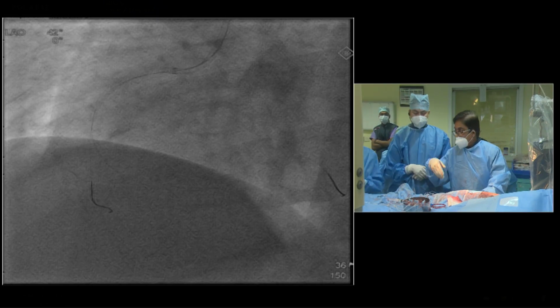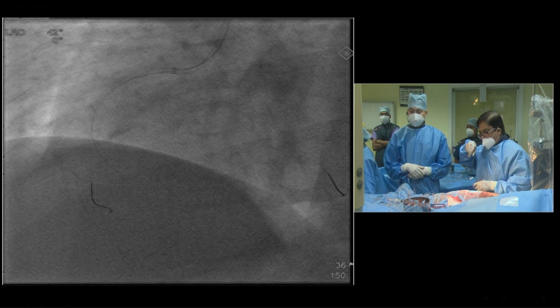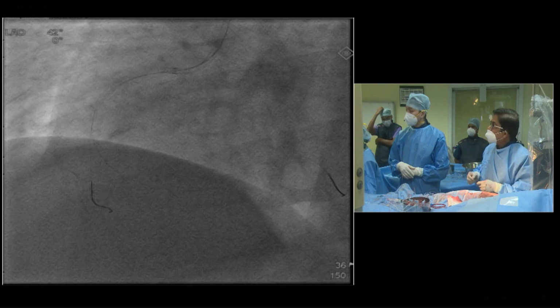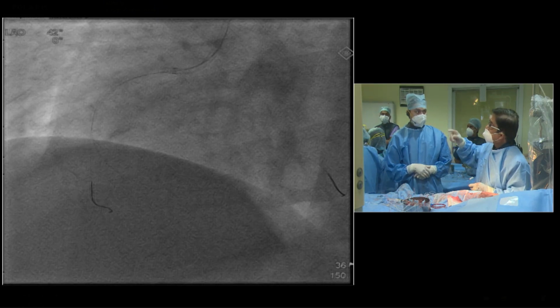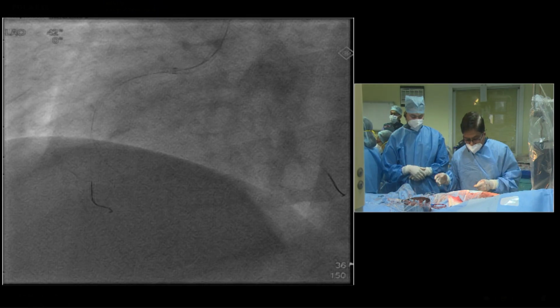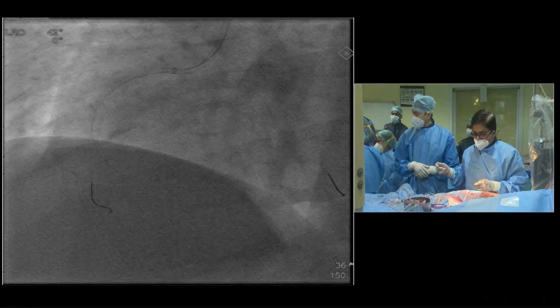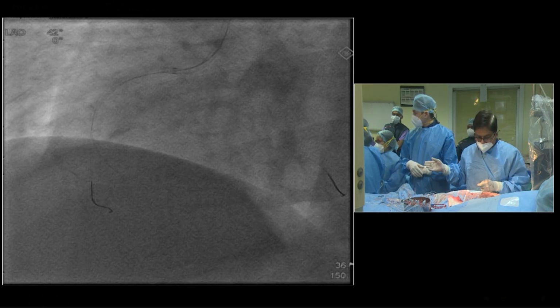Let us have a 48 millimeter 3. Actually, we wanted to finish it, but because of your interesting discussion we are just holding on. Chaliye. You will be getting a flight. I have to also get a flight. I am looking at the clock. No problem. If you have any more interesting questions you wanted to ask him, you can ask.